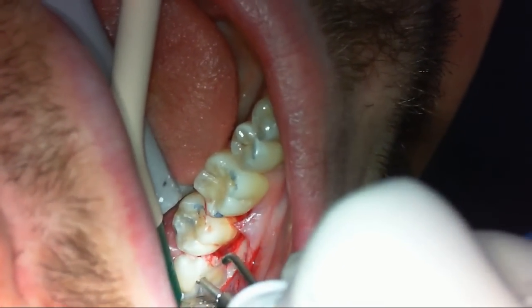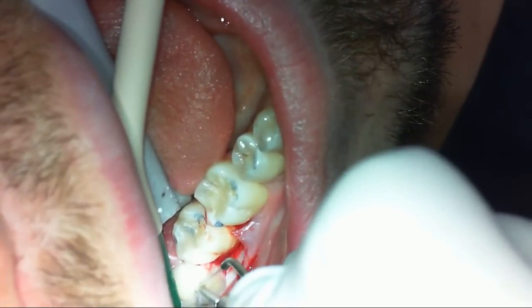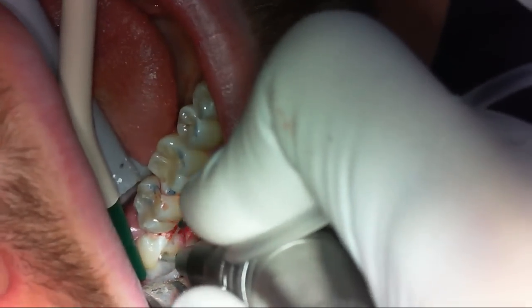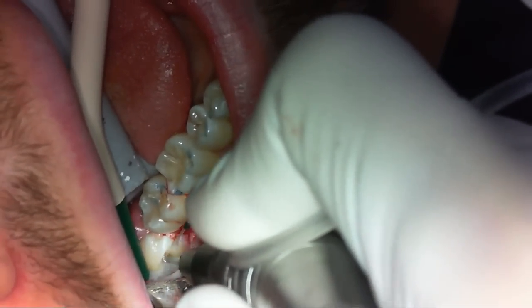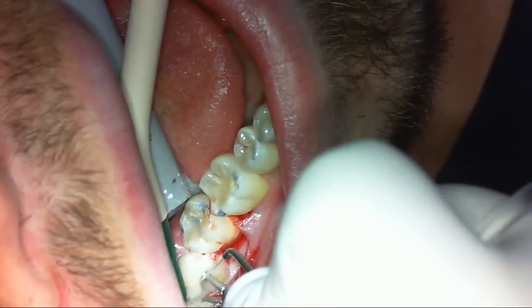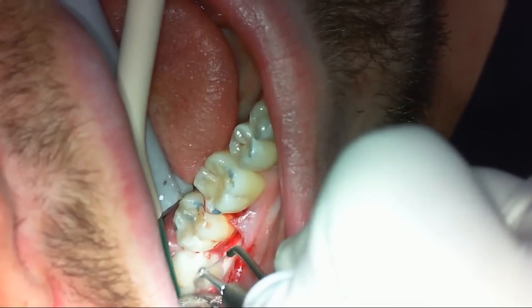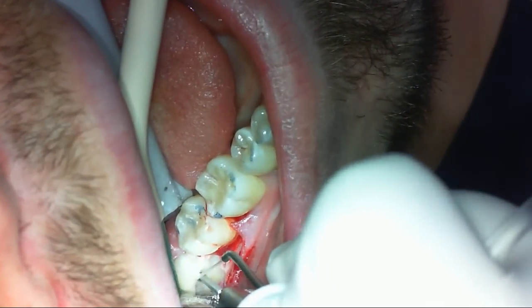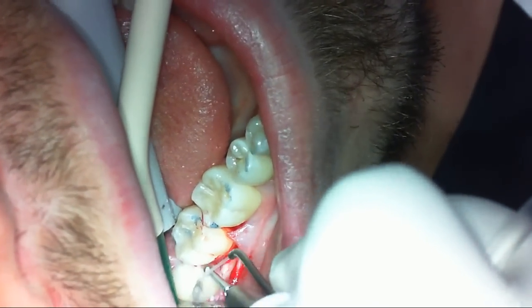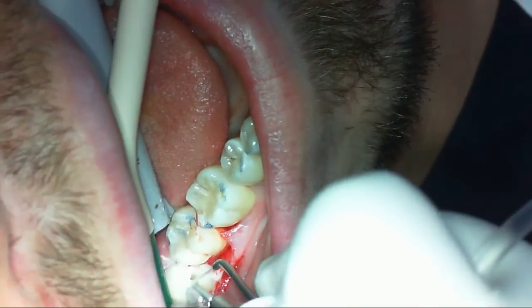Once you see some bleeding from the crown, you can see the round area — that's the pulp chamber. Now I know I need to go a little bit apical and a little more coronal as well. It's much easier to undermine the enamel and move from inside to outside. If you try to cut through enamel with a round bur at 40,000 RPM, you can overheat the bur or handpiece and it can take longer.